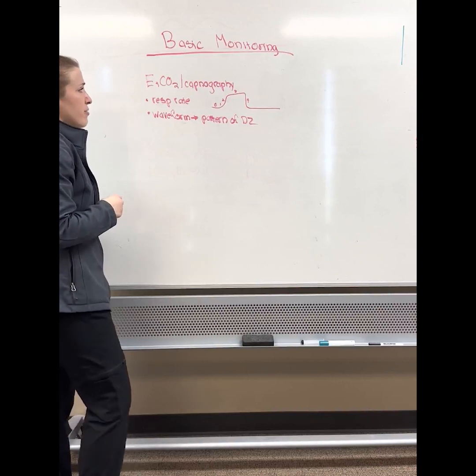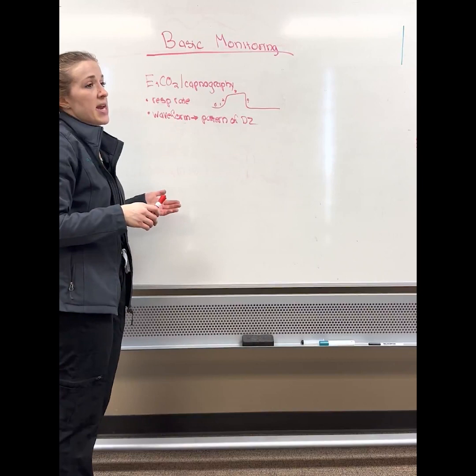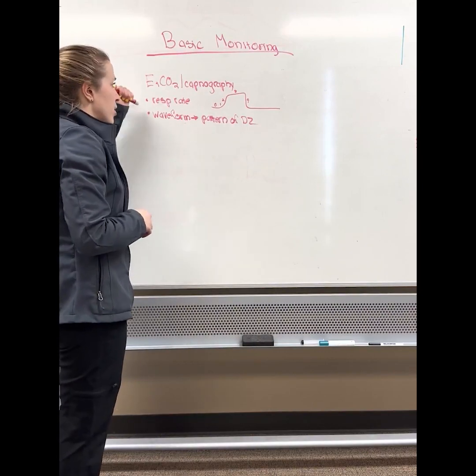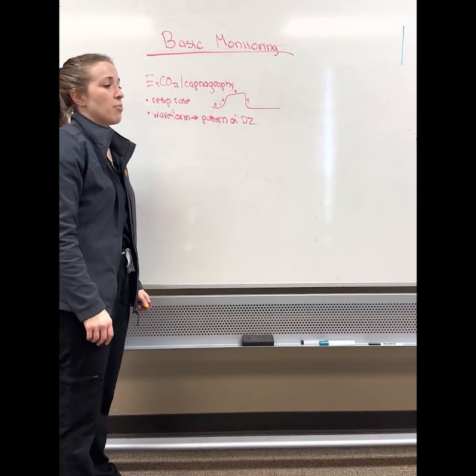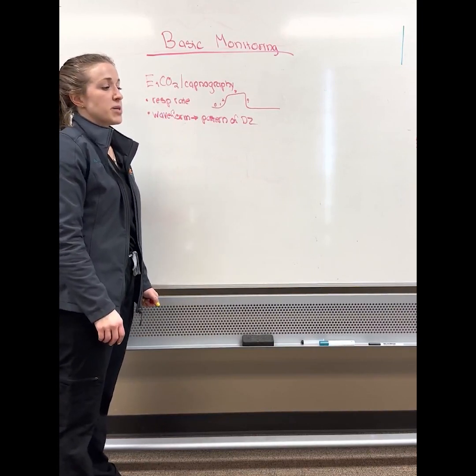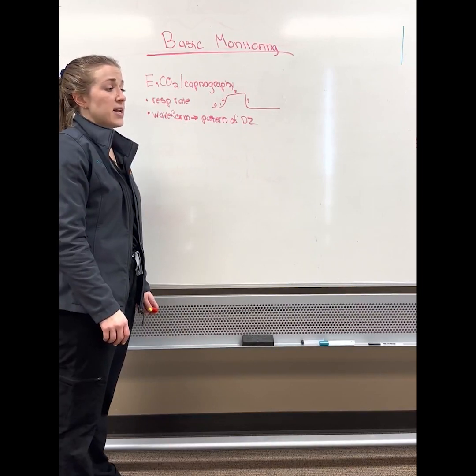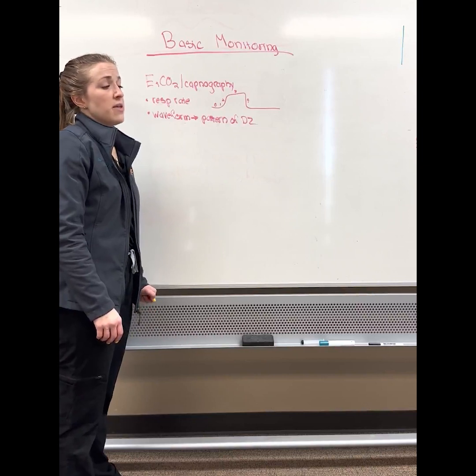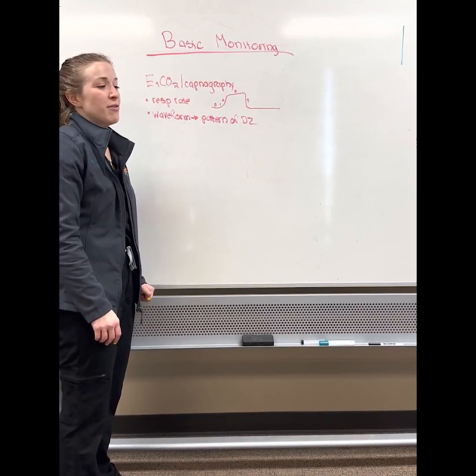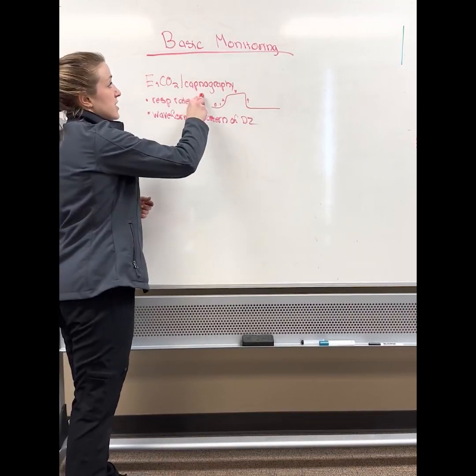So the idea behind capnography is not only to measure respiratory rate and the amount of CO2 the patient has, but capnography also tells you about cardiac output, and that is because living animals produce CO2 as a byproduct of metabolism. So that's why in CPR, when your patient is dead and there is no cardiac flow, the CO2 is really low, because we need the heart to pump that blood from the periphery to the lungs, and then at the level of the lungs, the CO2 is eliminated.